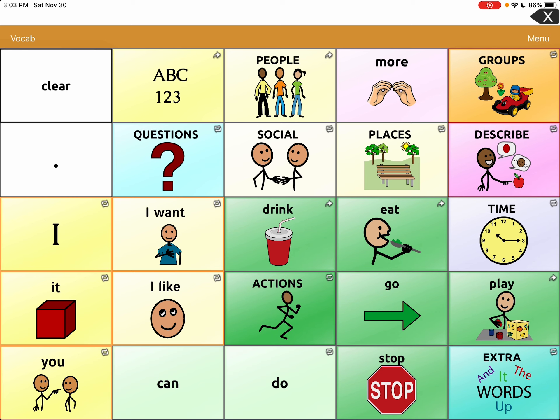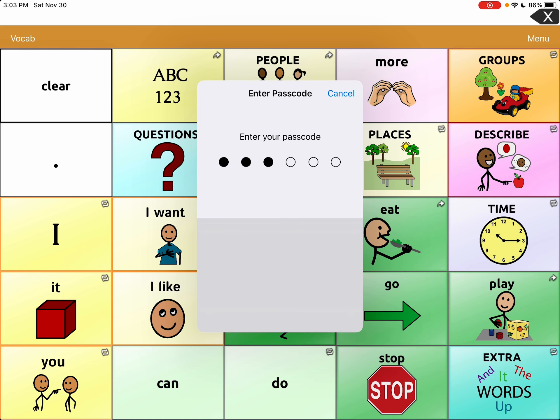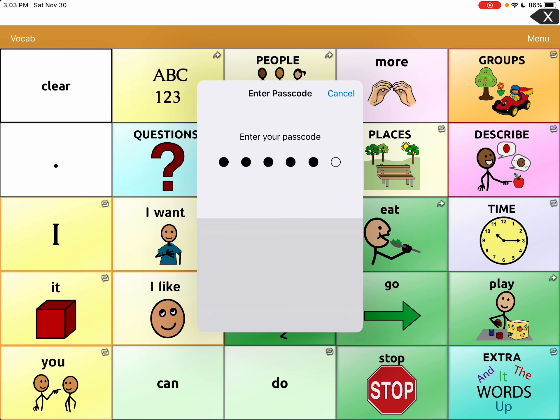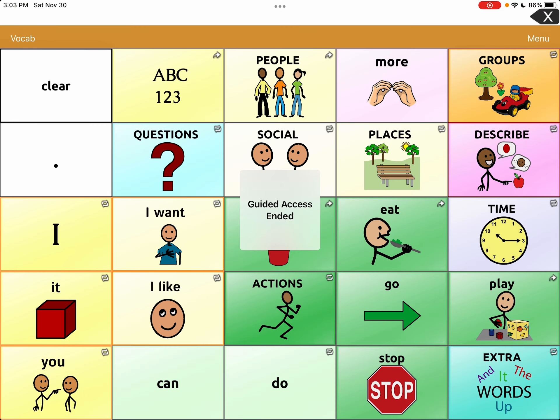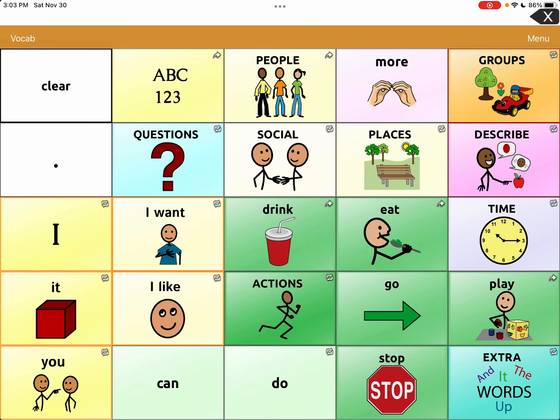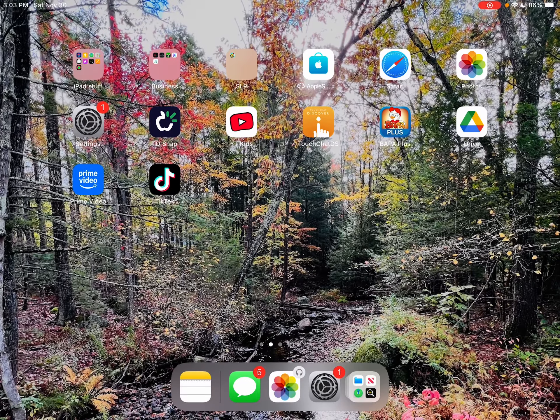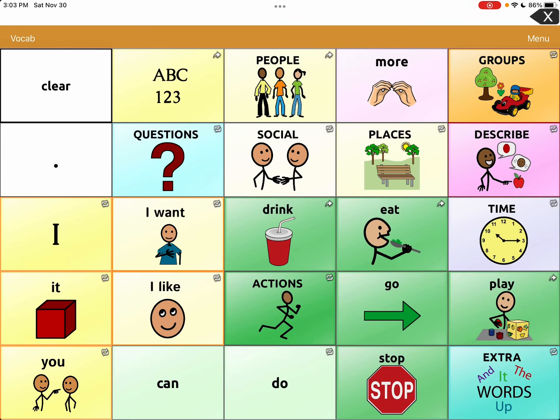To get out of guided access, hit the home button three more times — one, two, three — then enter the passcode you set. It will say 'Resume' or 'End.' Choose End, and guided access has ended. You can see you're able to come out of the app now.